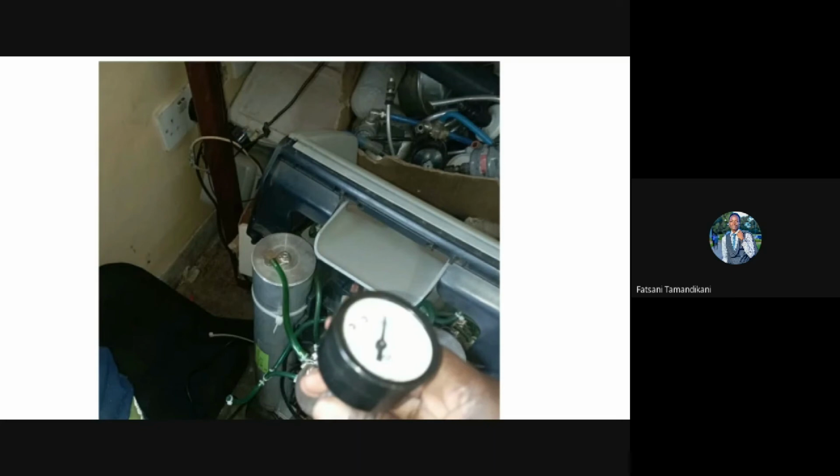The pressure at which adsorption occurs is called adsorption pressure, and this pressure ranges between 20 psi to 30 psi for most concentrators. When the pressure supplied to the sieve bed drops, the efficiency of the adsorption process also begins to drop, and this can result in a significant drop in purity produced by the concentrator. So you need to make sure that the pressure at the sieve bed is within the 20 to 30 psi range. You can measure this pressure at the outlet of the sieve bed as shown in the graphics. The graphics show a sieve bed in an AirSep concentrator, and to its outlet we connected a pressure gauge, or you can connect any other pressure measuring tool.